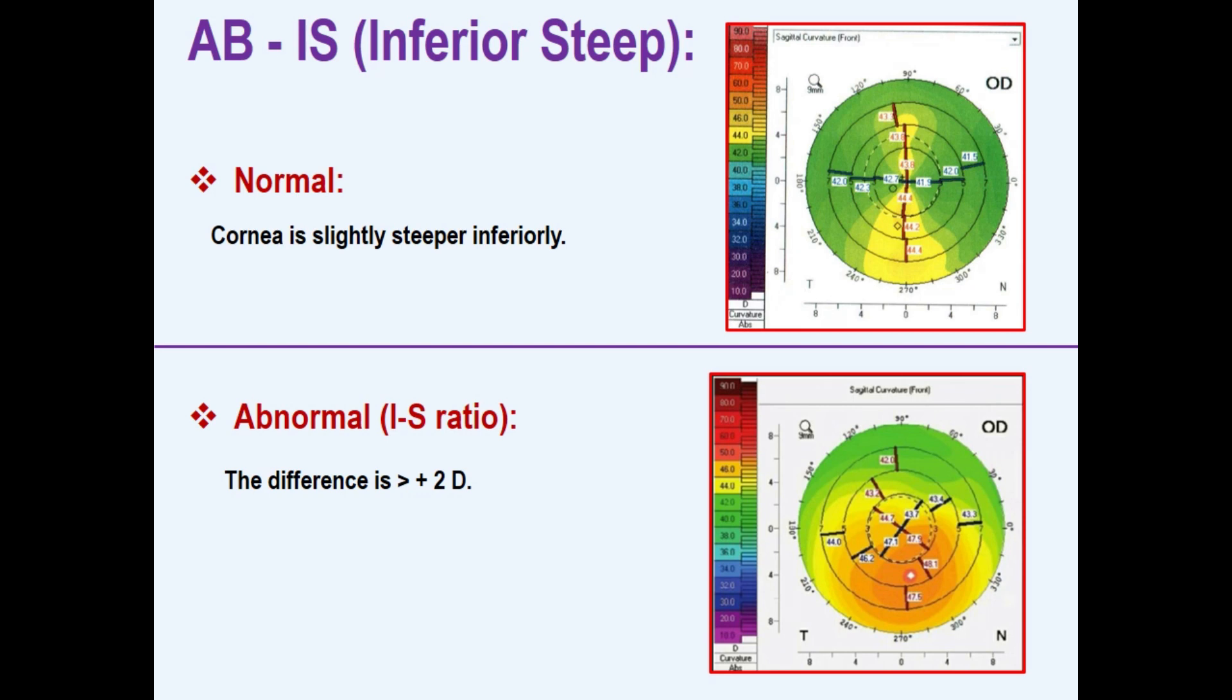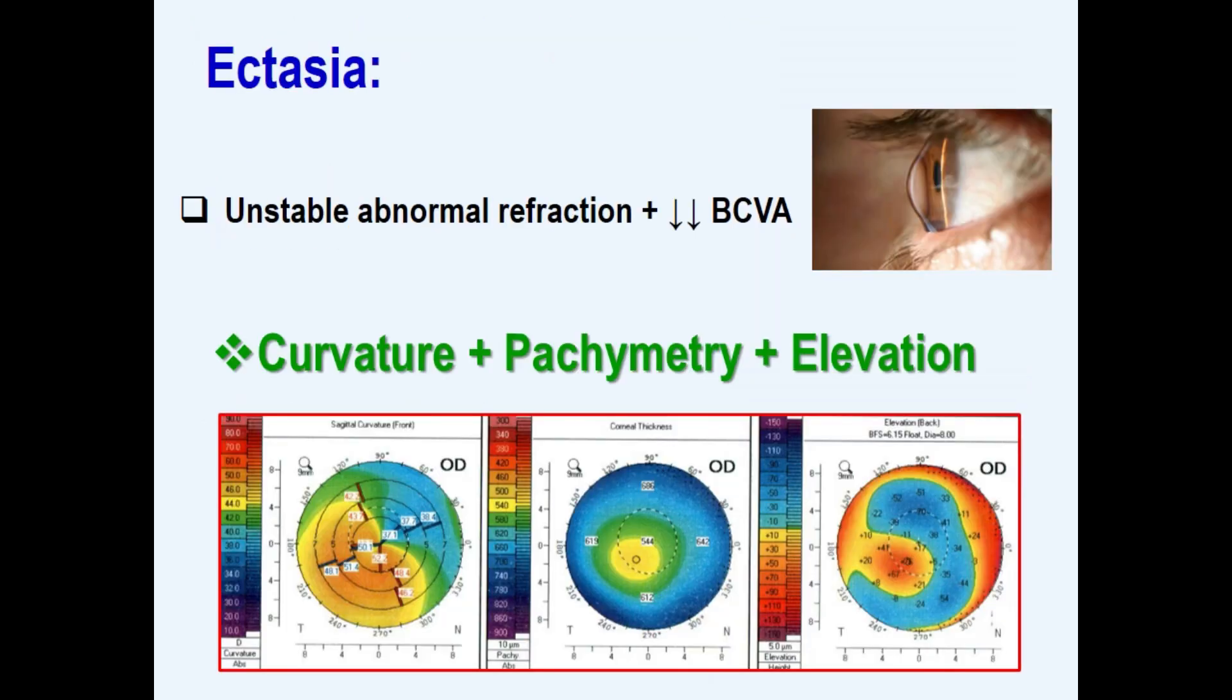In this case, the steep area is located inferior or infra-temporal to the corneal center. Clinically, patients with keratoconus exhibit unstable abnormal refraction and significant decrease in best corrected visual acuity.